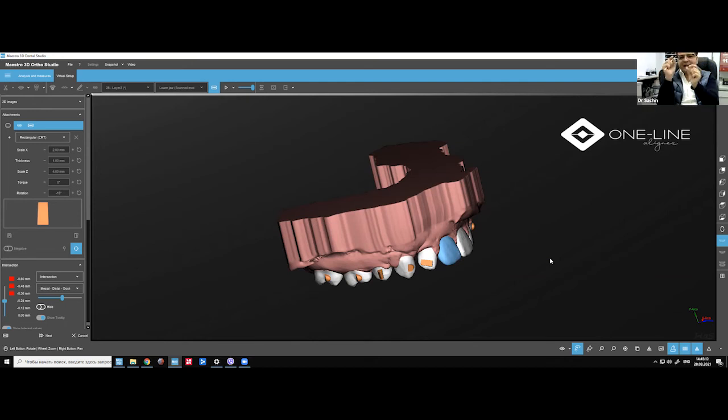Why? The yin-yang attachment, the double attachment, they are pretty small. They don't give you all the time the movement that you need. But this attachment being bigger and thicker, it will give you the downward movement and the upper movement together. So actually, if you want to ask me, for tipping for smaller teeth, this is a better attachment than the yin yang one.